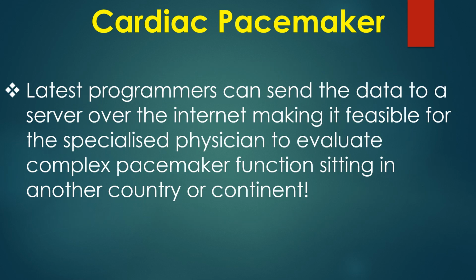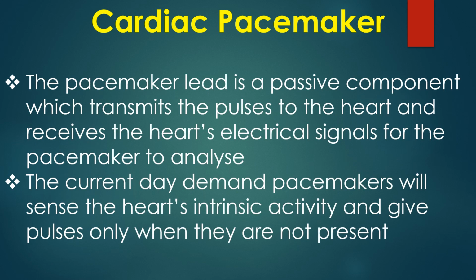Latest programmers can send the data to a server over the internet, making it feasible for the specialized physician to evaluate complex pacemaker function sitting in another country or continent. The pacemaker lead is a passive component which transmits the pulses to the heart and receives the heart signals for the pacemaker to analyze.